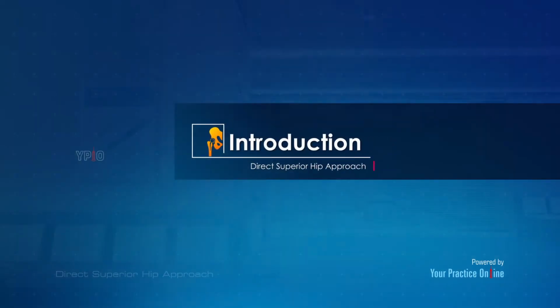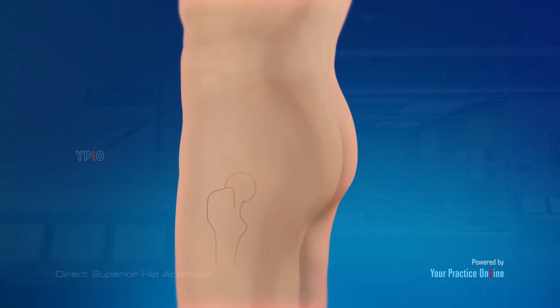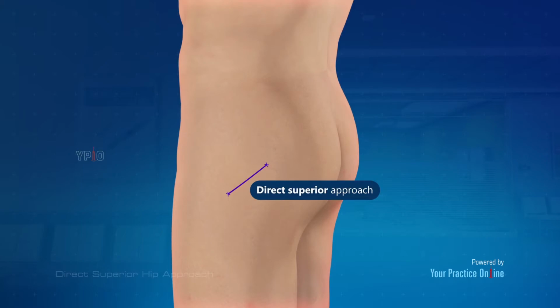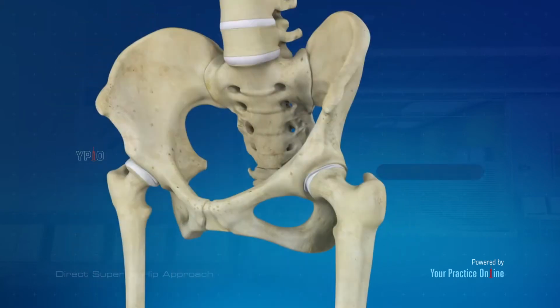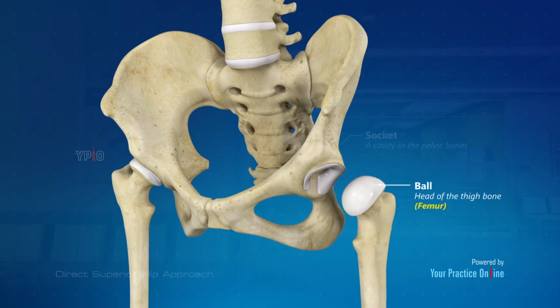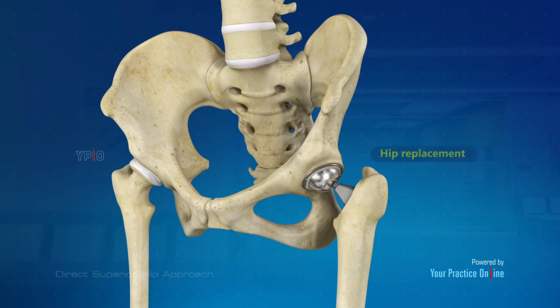Introduction. The direct, superior approach to hip replacement is a minimally invasive procedure to replace a painful or dysfunctional hip. The hip joint is a ball and socket joint with the head of the thigh bone or femur forming the ball and a cavity in the pelvic bones forming the socket. Hip replacement surgery involves replacement of all or part of the diseased hip joint with artificial components.